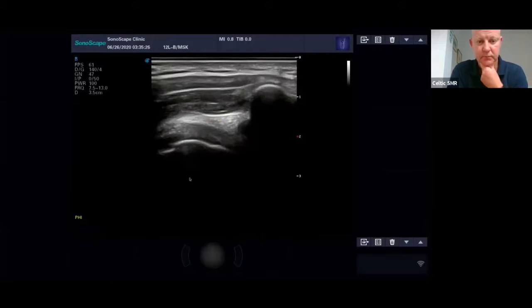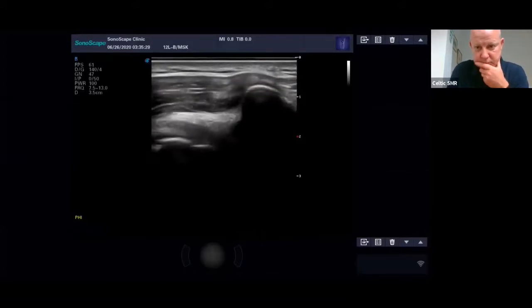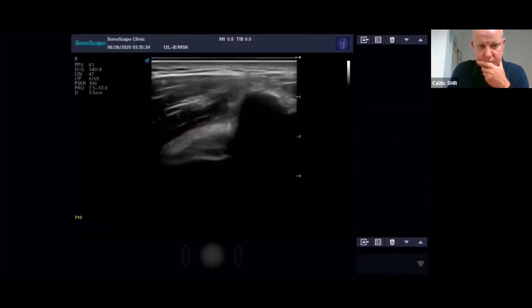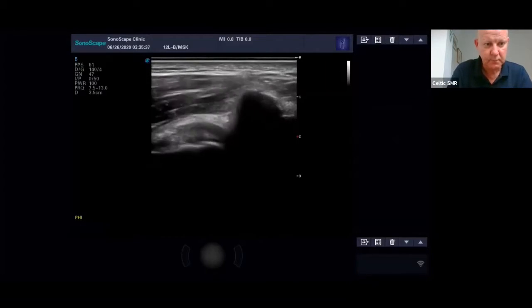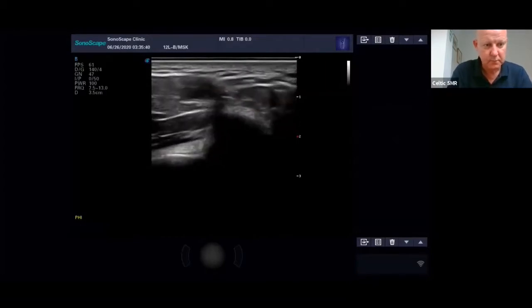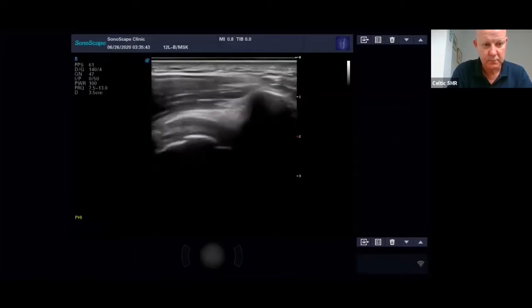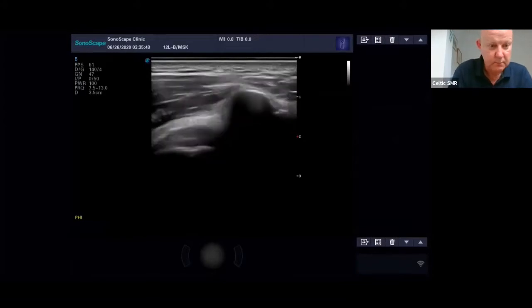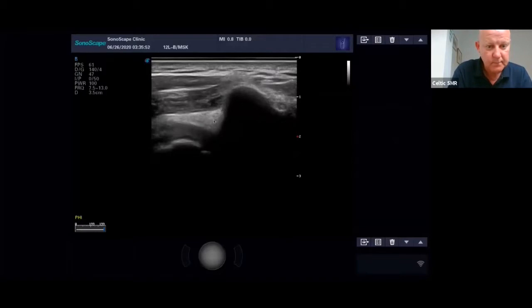So if I take that off now, you'll see as I raise his arm up and it rotates underneath, you can see it's going under there quite nicely. You're not feeling any symptoms there, Abid? No. So you can see he's got quite a thickened bursa, but it's going underneath, and it's not impinging. What you tend to see with that is basically bunching. It'll bunch up here, it'll bulge here. You might even get a little bit of fluid bulging up as well. And then the patient will tell you that that hurts, and that's your impingement sign.